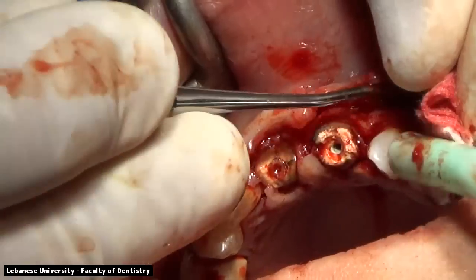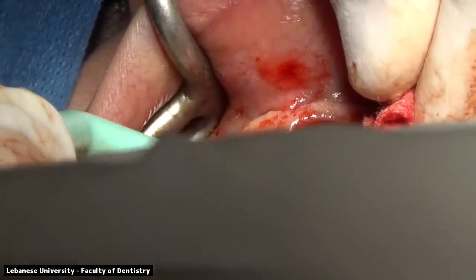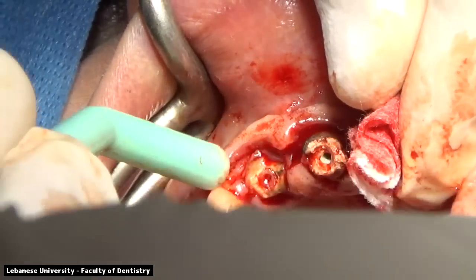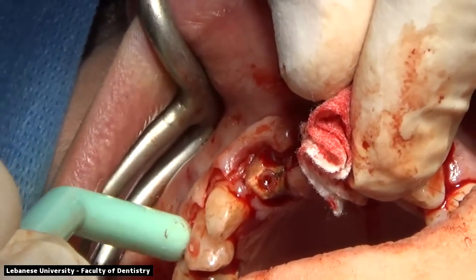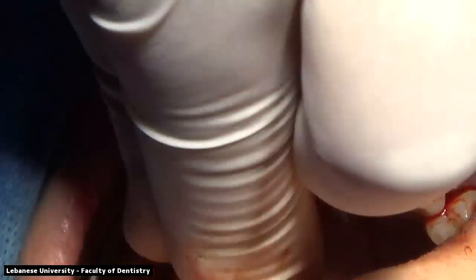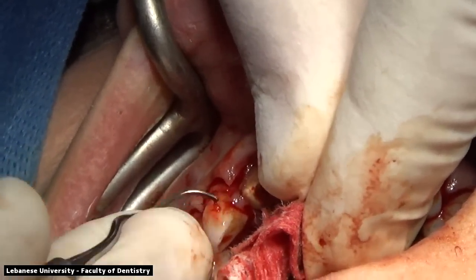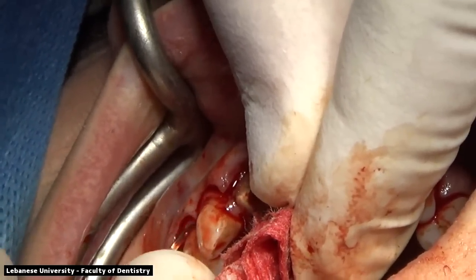The flap has been elevated from both the buccal and the palatal side. We can see the clean periosteal flap elevation, and the bone is clearly evident in this case. There is some bleeding due to the granulation tissue and the fibrous tissue that's present because of the infection and the fracture at the right central incisor.